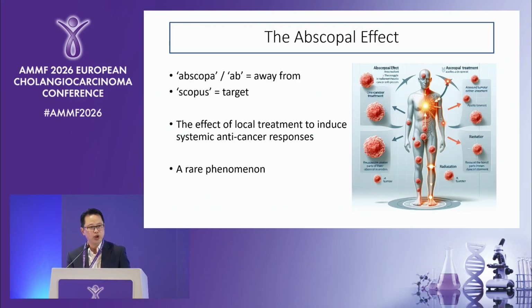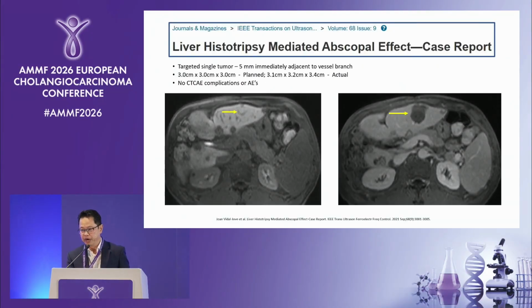It is a rare phenomenon, but it is better described in patients with histotripsy versus other patients, for example, following ablation or radiotherapy. And this is a case.